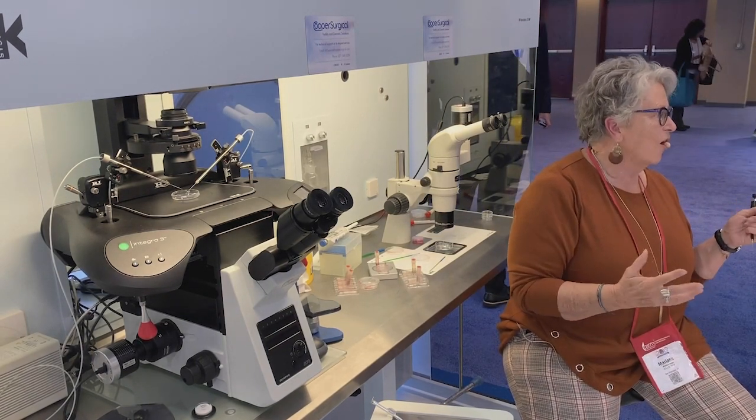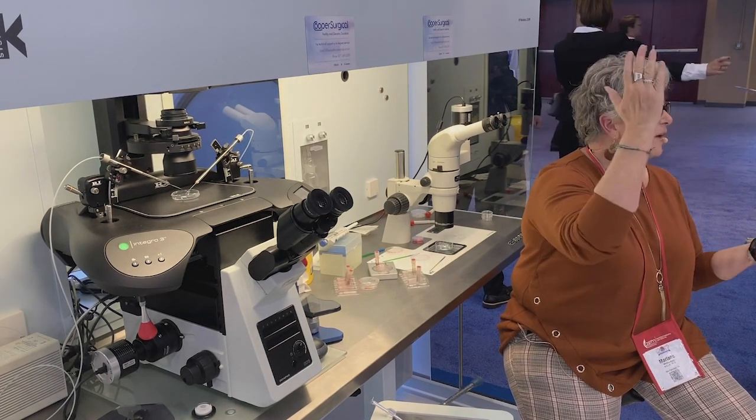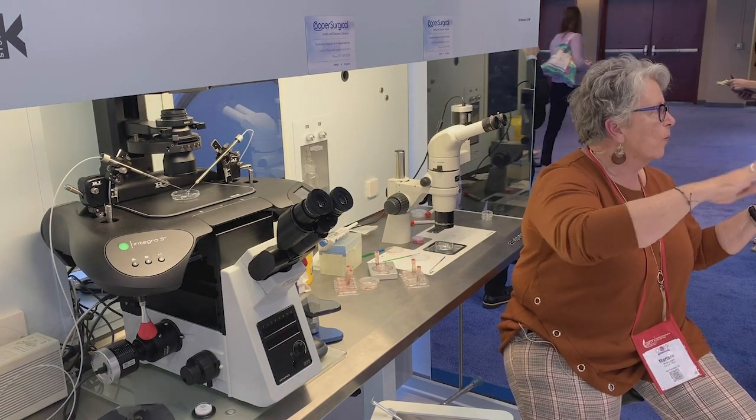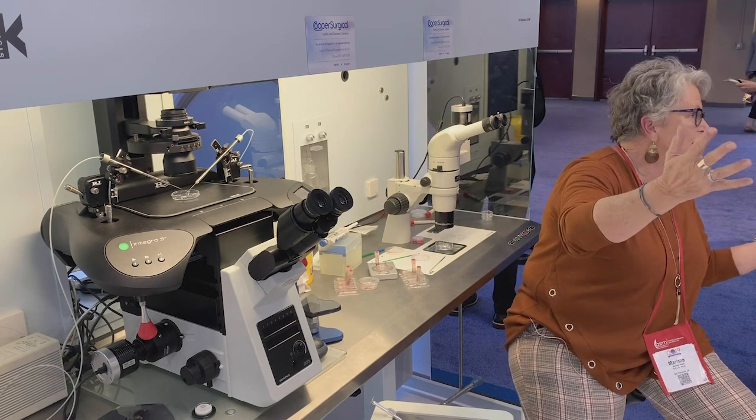And they'll drop it on you too. And that must have been what they did to have this thing. So we have broken devices, things out of the goblets, no caps on anything in 4 blocks. So imagine what's happening if you ship your samples across the country.